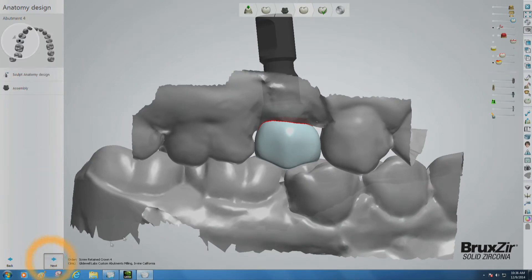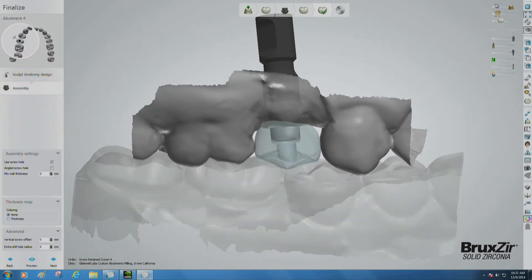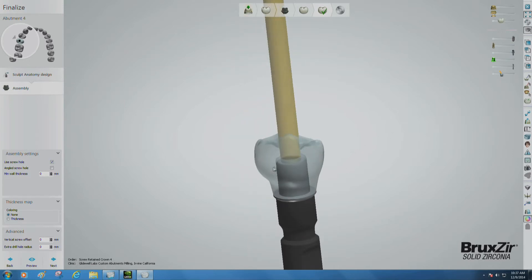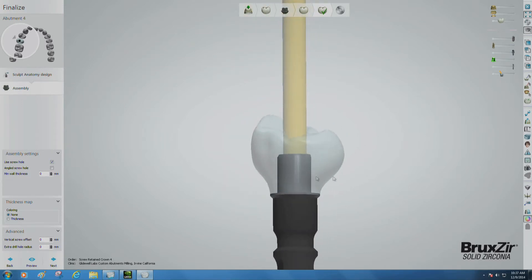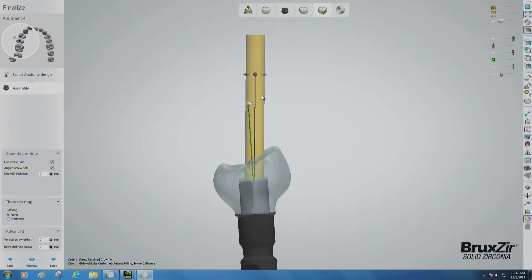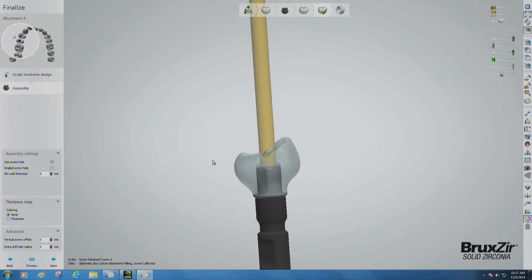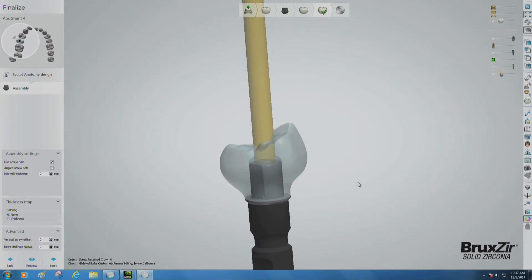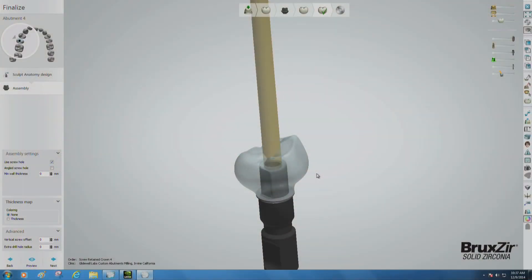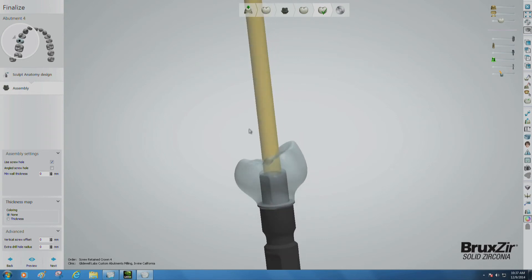Then click Next. At the assembly stage, the program asks you to review the screw-retained crown before it is sent to milling. Make sure you haven't clicked the check box in the lower left corner of the screen that enables an angled screw hole — we've found that most milling machines can't handle that request. A straight screw hole will auto-generate directly down the titanium insert following the set path of insertion as you enter the assembly stage. This function may cut through some of the desired occlusal anatomy, but you can fix that with some chair-side composite at the time of delivery. When you are happy with the entire design, click OK to create the finished design file.